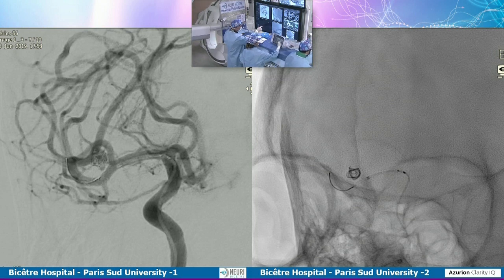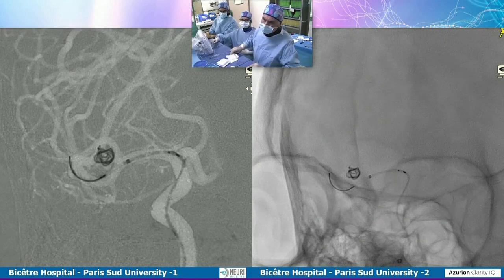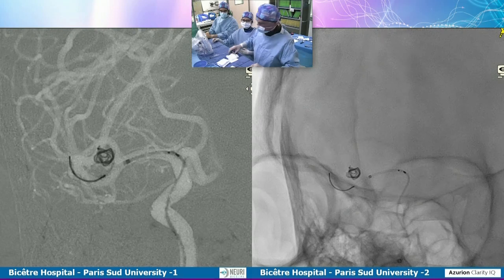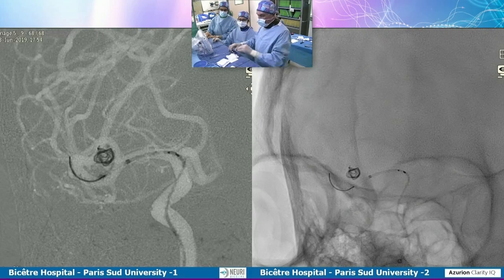Now, I agree that when you have such a difficult angle, or with this lobulation on that upper branch, it makes it more logical to just place the stent in the lower branch. But remember, there's a lot of data, including some that we have published in 2 or 3 papers in the past, that tells you that the smaller bifurcation areas take longer to close when they do.